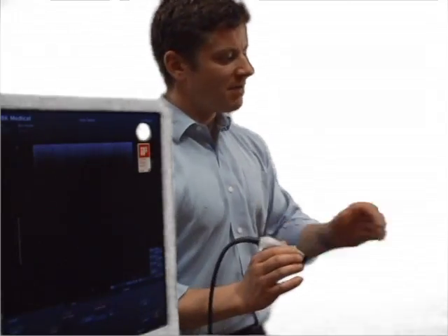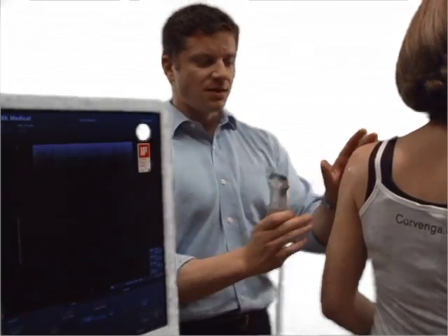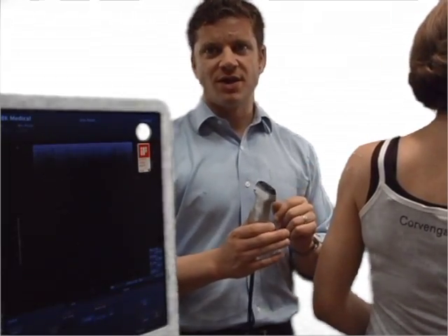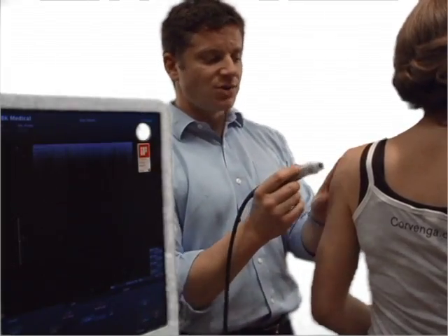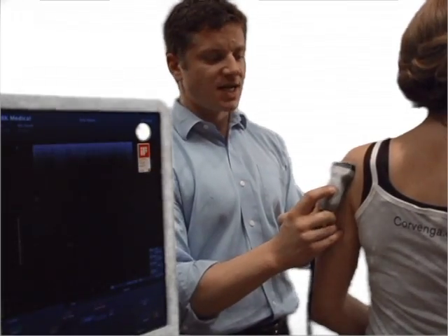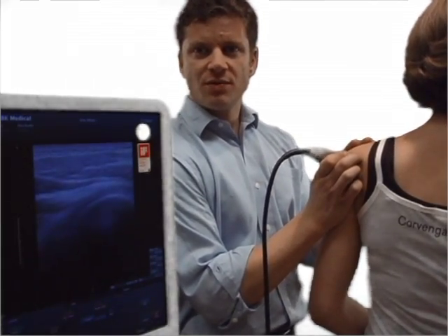I'm going to take my model here and bring her in so that you can see how I'm positioning the transducer and the corresponding ultrasound image. The glenohumeral joint — this is going to be the posterior approach. The anterior approach is also possible, although it's less favorable than the posterior, so that's the one we're going to focus on today. I'm going to lay the transducer across the humeral head, slicing in the transverse view, and place it right over the humeral head where the joint area should be.